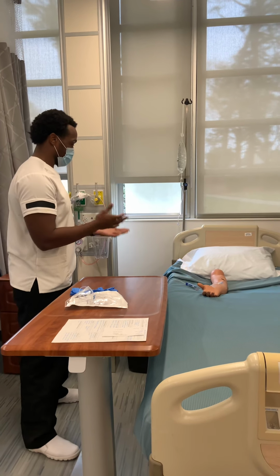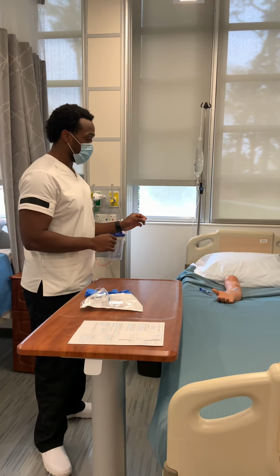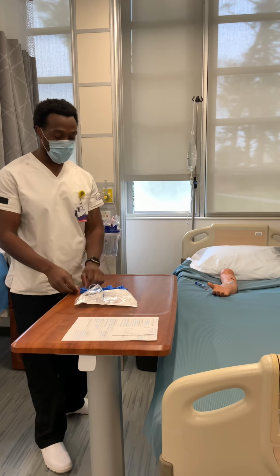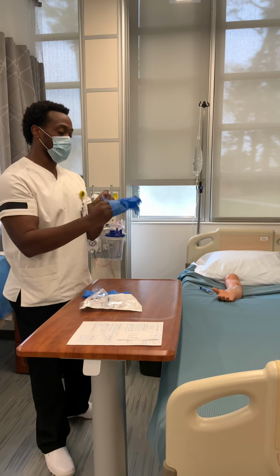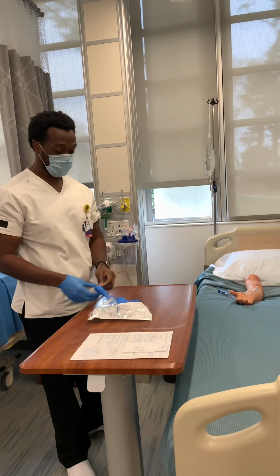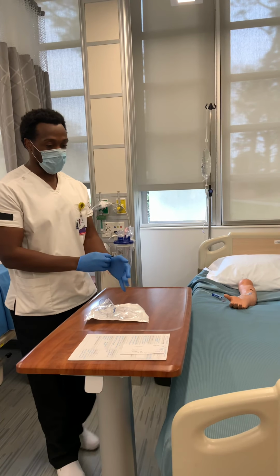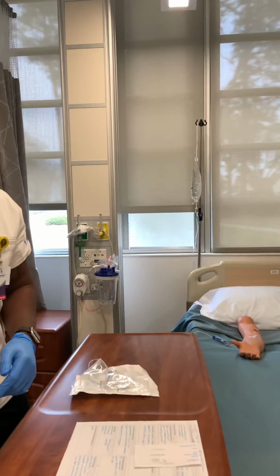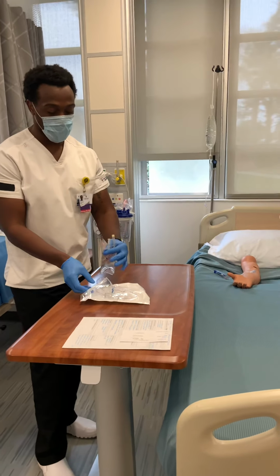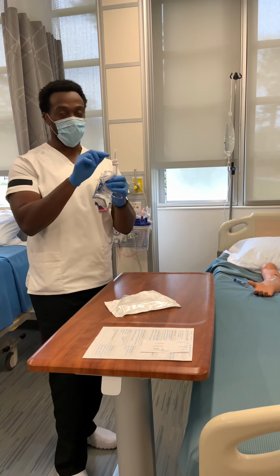Then I would make sure the medication on the IV packaging matches the patient's name and the MAR. I would perform hand hygiene and don clean gloves. I would have a bag with my IV solution right here. I would take it out and lay it flat on the table, and I would open my packaging and take my tubing out, trying to keep the tip sterile.